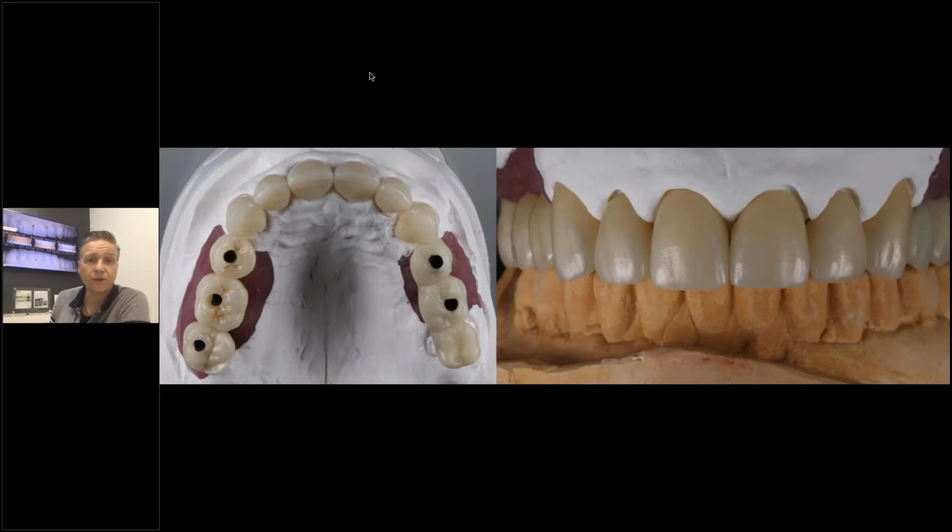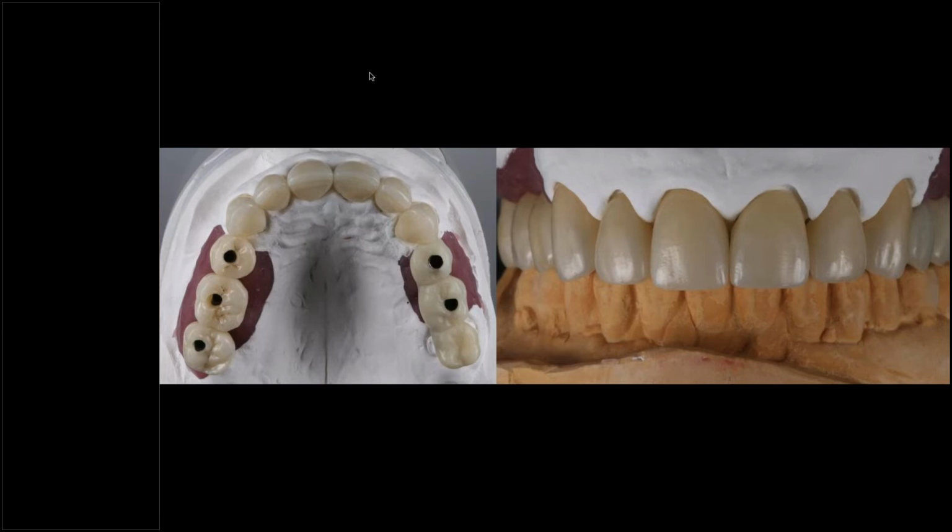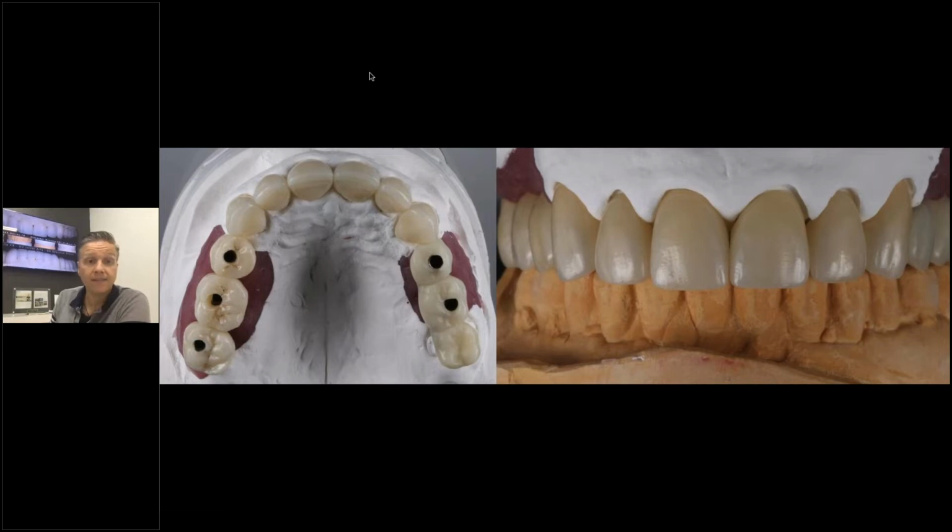usually if you do something like this, it's a full arch on the patient's left side. The screw retained bridge with the cantilever is a temporary, so don't judge me on the color there, please. It's just a temp. On the other side, these are 3 screw retained crowns in HT Plus monolithic, and canine to canine is Zolid FX. So I can also combine different zirconia materials together for different reasons.